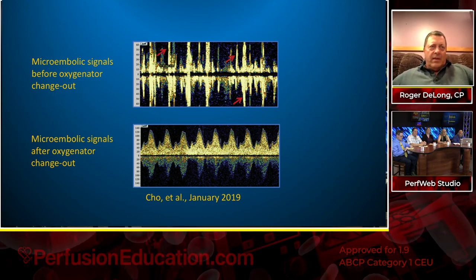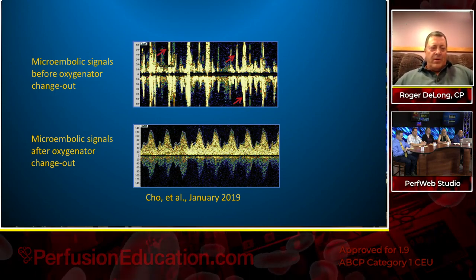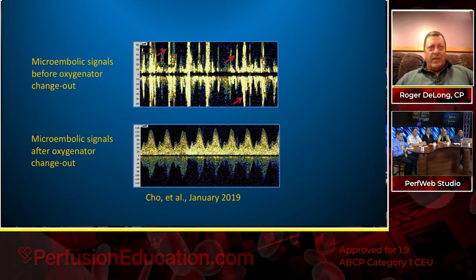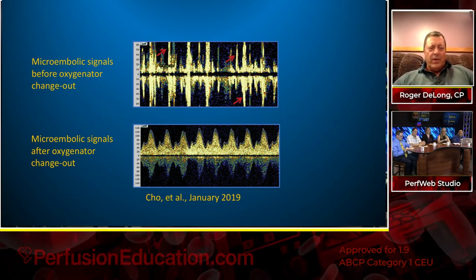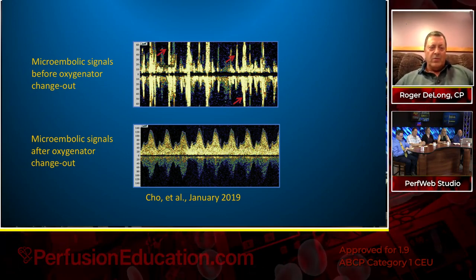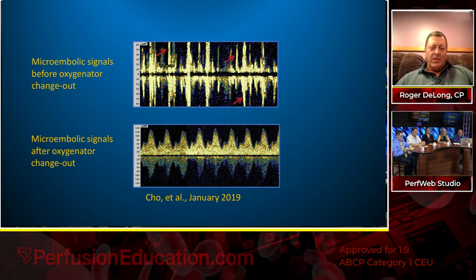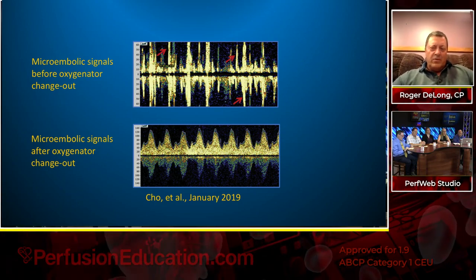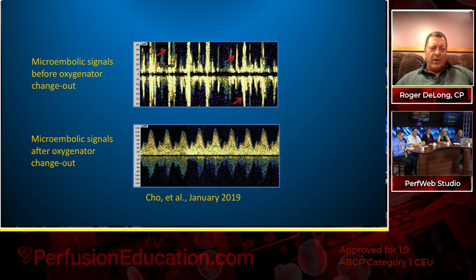We tend to deal a lot with just tubings and circuits and pressures and flows, but we don't directly address, other than the NIRS, which some people call a random number generator, we don't really look at functions perfusion-wise in the brain. That's true. I thought this is a pretty smart thing to be able to do, because after all, it's what we're trying to do the most, is protect not just the patient's organs, but most importantly, the brain.